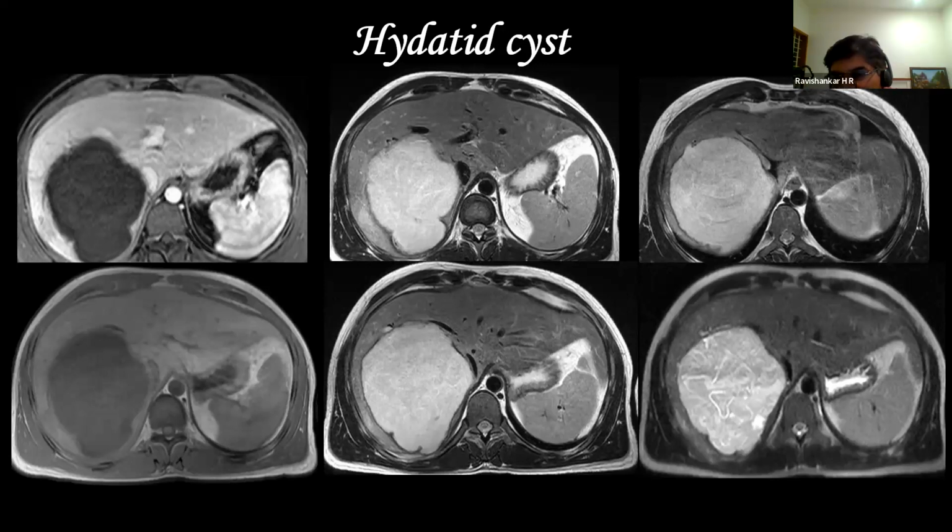We'll have another class about MRCP and maybe breast, an MR mammogram, which may help us. Sure, we'll have that. Thank you so much, Radhesh. Two things we will do: one is MRCP, and one more, some bowel lesions we'll look at. Yeah, that's so important. Look at MRCP also, Ravi, you can probably do it next class. Yeah, whenever.